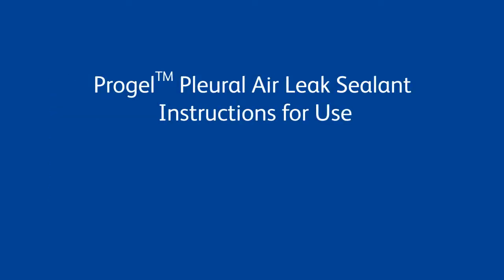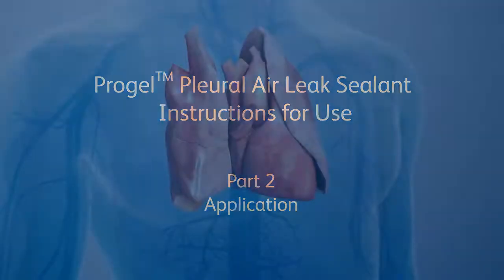Progel Pleural Air Leak Sealant Instructions for Use, Part 2. Sealant Application.